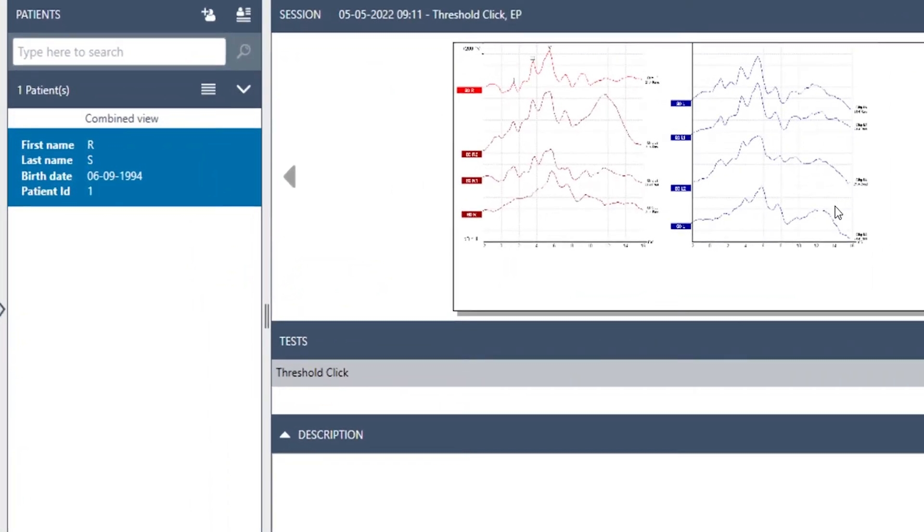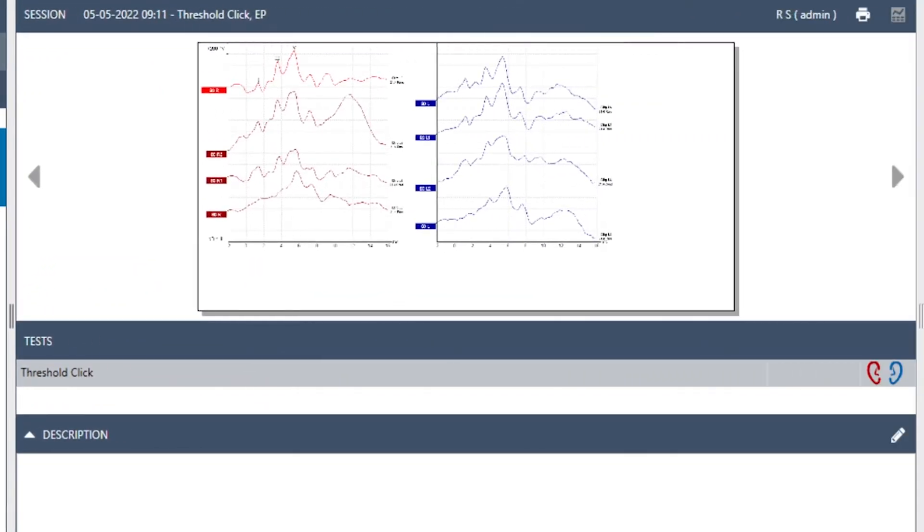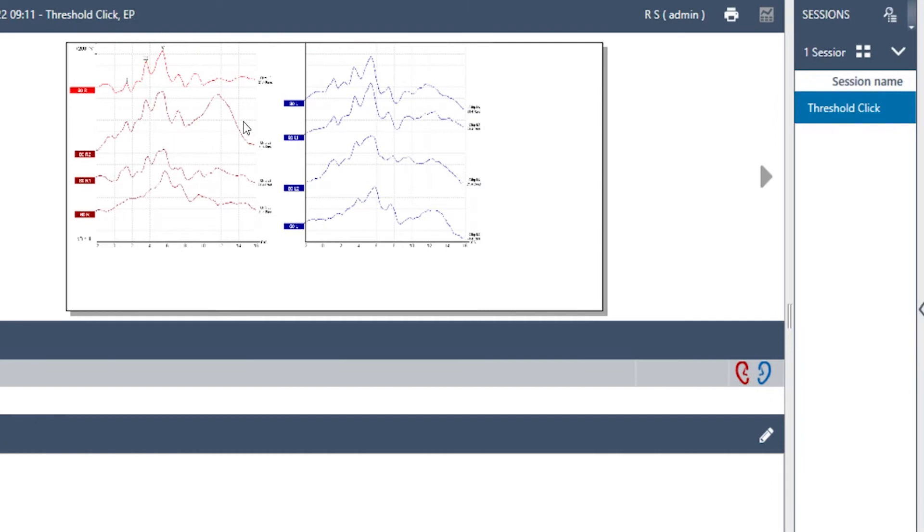You have the patient's name on the left, and to the right you can see the session.